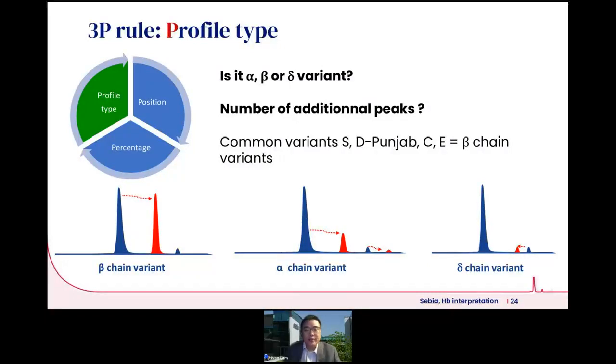First, look at the profile type. Recalling that for the different alpha, beta, or delta variants, there is a different signature in the profile type of the splitting of the globin. For a beta variant, because the beta gene is only present in hemoglobin A, you see just one splitting of hemoglobin A. For an alpha chain variant, you see multiple splitting of all the hemoglobins because every hemoglobin requires the alpha chain, except for the most abnormal types where alpha is totally deficient, in the thalassemic conditions. Otherwise, with alpha chain variants, every hemoglobin will be split.